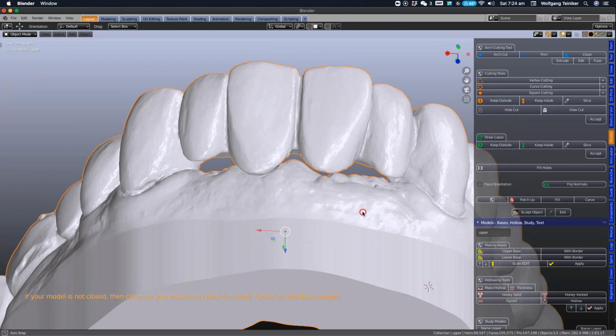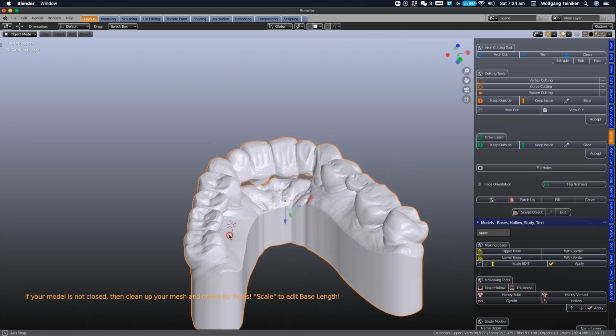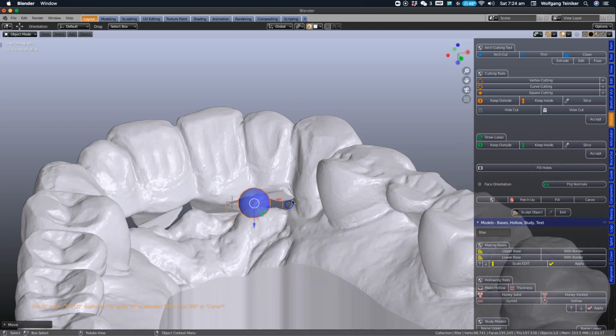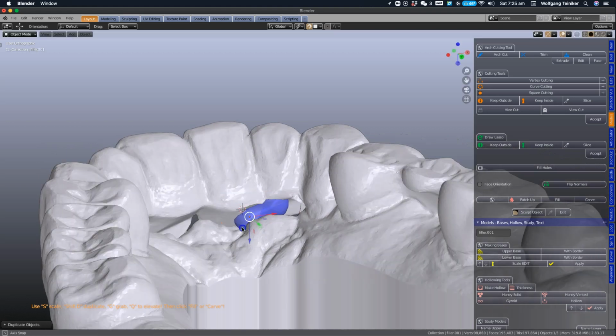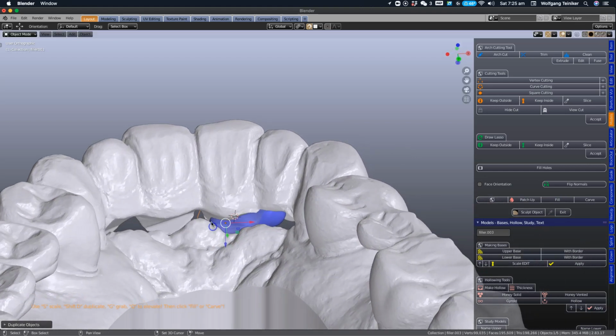But so you could save this, and then like I said, you can print it, but we may want to just plug these areas underneath. It's very easily done. We're going to use a patch tool. And this is like working with wax. We can expand the sphere and we can move it around. So we're going to use like a G key. And actually, yeah. So I'm going to place it underneath. Then we're going to duplicate that. And then just flood this area underneath with a bit of these little bubbles.